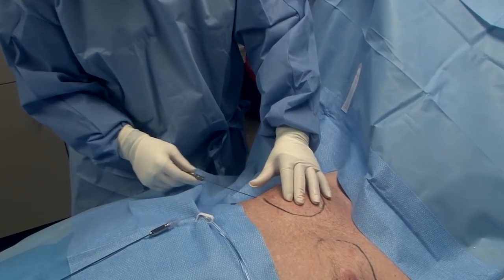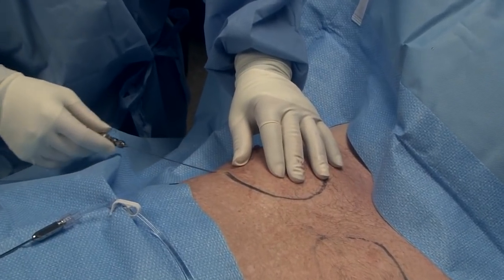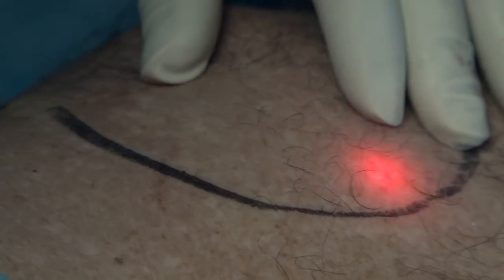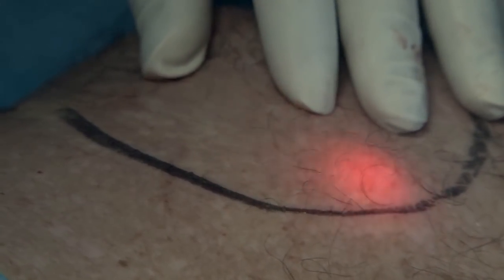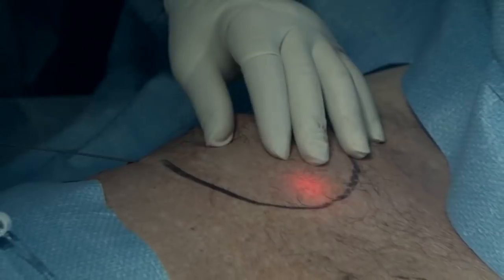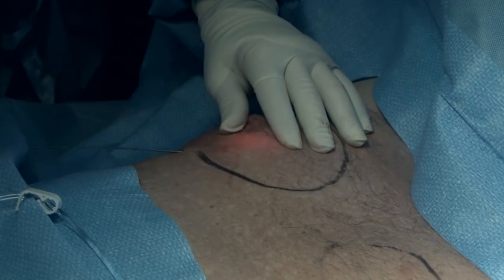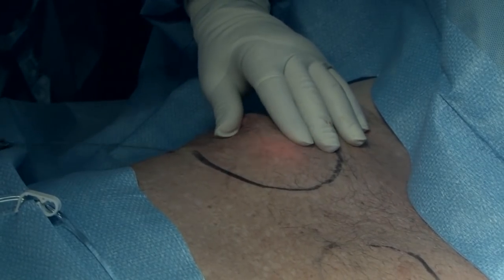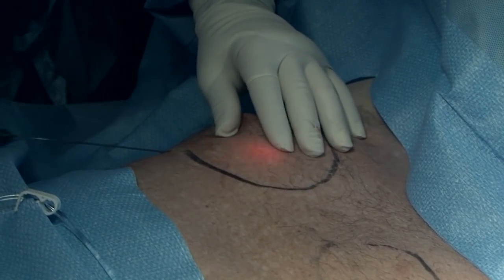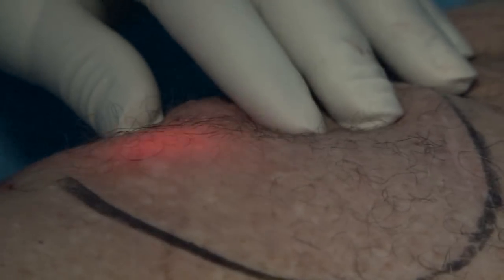Here we are starting to put the laser through the opening. It's just a slow, gentle process. I know exactly where I am because I can see that red light through the skin, and that means we're in the right spot. It's very superficial — we're not going down deep, so we know we're not injuring any structures underneath the fatty tissue. On the laser machine itself, it's telling me how much heat or energy I'm putting in so I can keep track of that.